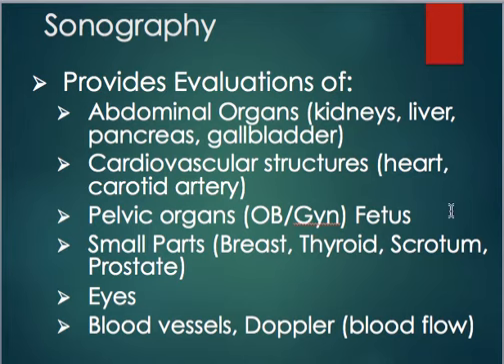Ultrasound is also good at looking at the eyes, so we can see if there's anything going on there. And it also shows blood vessels and Doppler, which is the flow of blood.